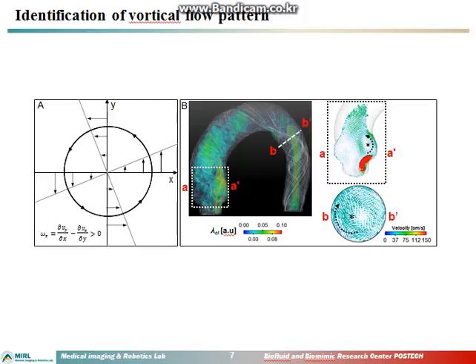The blood flow frequently generates vortical flow patterns in various vascular regions, including the left ventricle, the ascending aorta, and pulmonary vessels. While the detailed relationship between the vortical flow and the pathology has not been fully understood yet, the existence and intensity of the vortical flow are known to be influenced by pathological conditions such as aortic aneurysm, pulmonary hypertension, and heart disease.